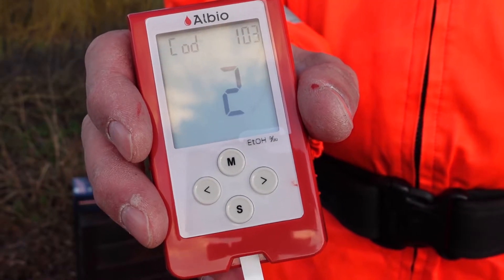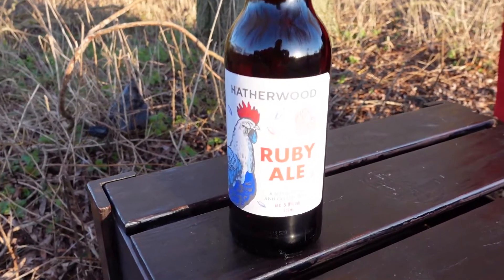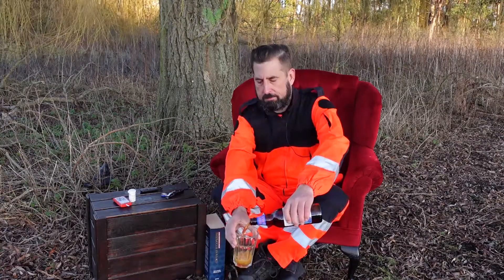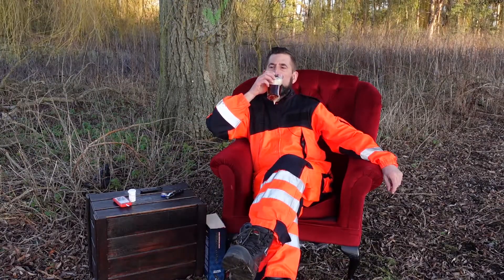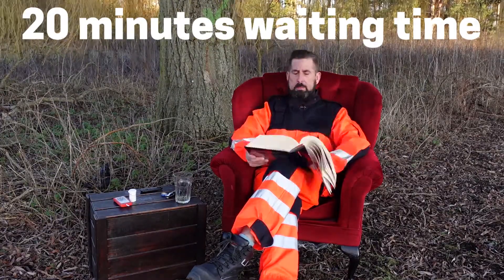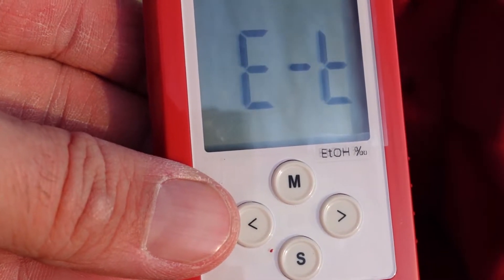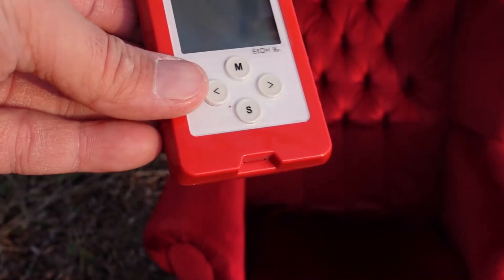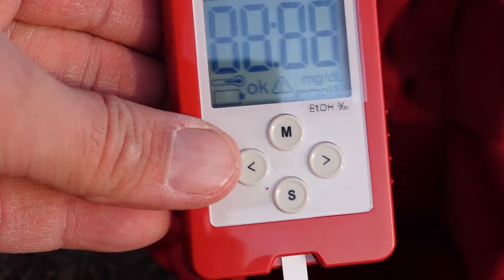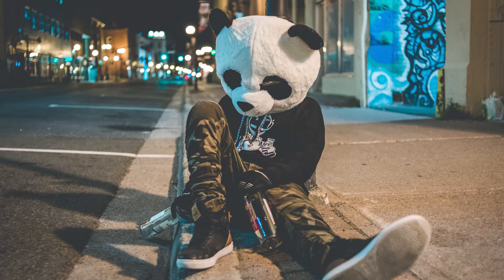But instead of blood sugar levels, of course it checks your patient's alcohol levels in less than 30 seconds. As a testing alcohol, I've chosen the cheapest beer I could find — because why not? The first test and the first disappointment: the British winter at plus three degrees is too harsh for Albio. The minimal temperature for the device to work is 10 degrees, so please remember that before you decide to check your patient sitting outside of the pub.